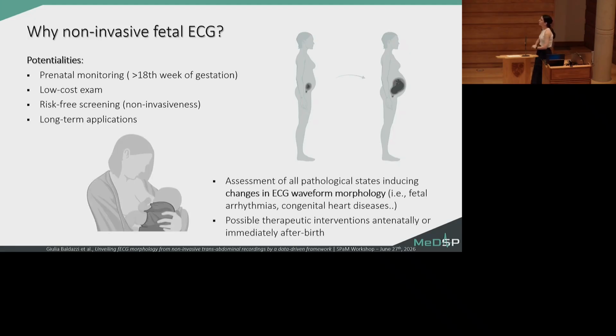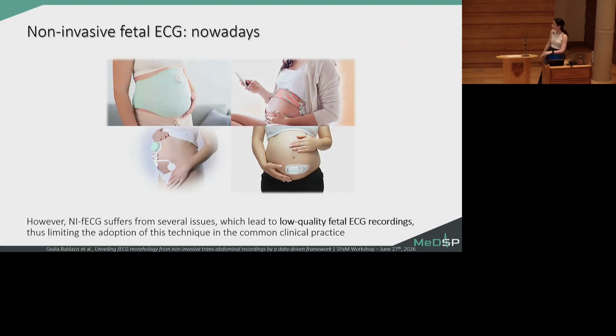But more importantly, it can be a powerful tool for the analysis of the fetal ECG waveforms that can be altered by several pathologies, or congenital heart diseases or fetal arrhythmias, and so allowing for a prenatal diagnosis and assessment of these pathologies, and so also for their possible therapeutic solutions, both in utero or immediately after birth.